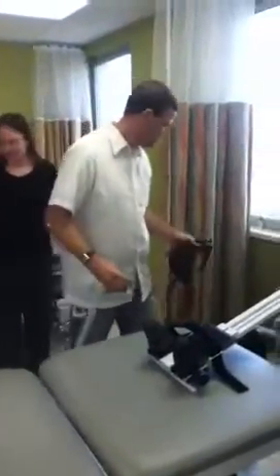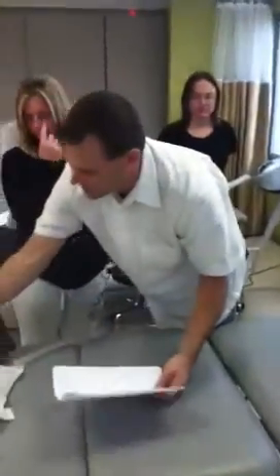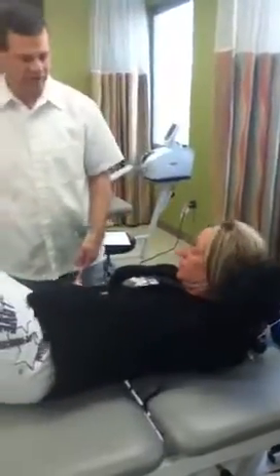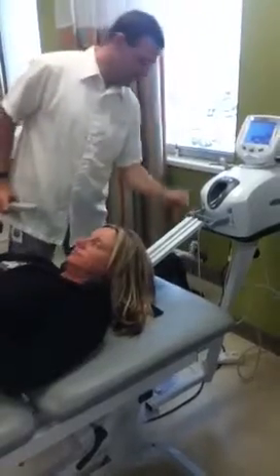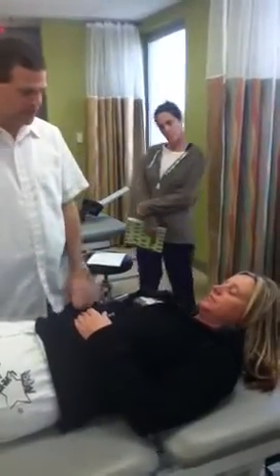Mitzi's going to be our patient. If you'll lay down, we're going to have your mat be roughly there. I've got a pillow here behind your legs to make it more comfortable. I'm going to go ahead and give you the kill button. So if at any time during this you're not comfortable, or if it's hurting you, just push that and it's going to stop.